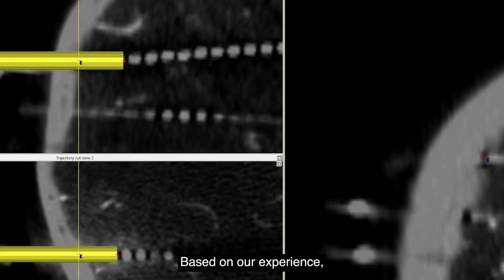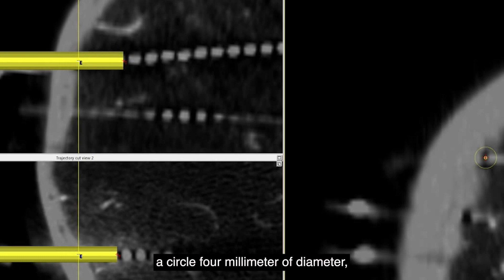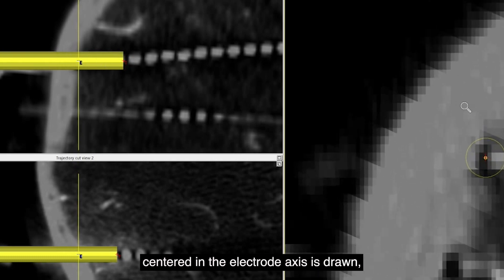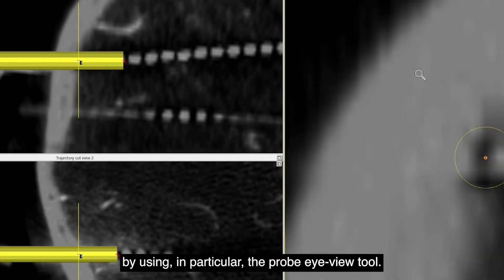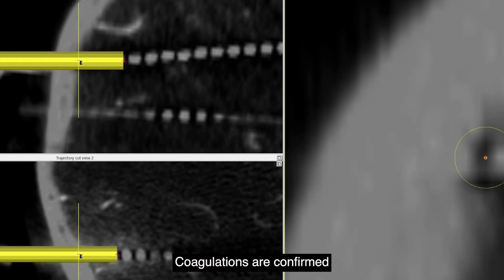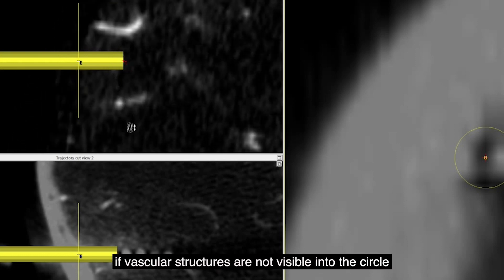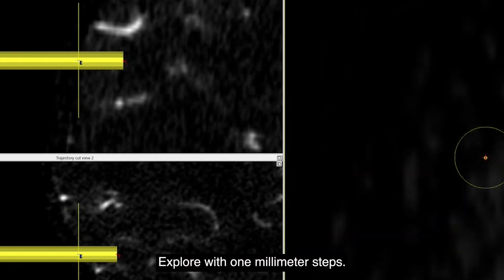Based on our experience and previously published experimental data, a circle of 4 mm of diameter centered on the electrode axis is drawn, checking coagulation feasibility by using the probe's eye view tool. Coagulations are confirmed if vascular structures are not visible within the circle along the entire coagulating trajectory length, explored with 1 mm steps.